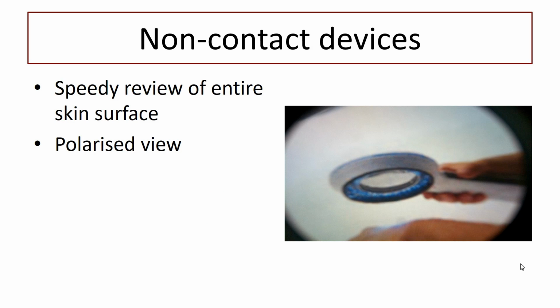So a non-contact device. Emily, we need you holding up the non-contact device. The Lumio is to be demonstrated for those of you, and the one next to it, the smaller Lumio. Yeah, those two. So these are non-contact devices, and they're designed for quick examination of the whole patient.